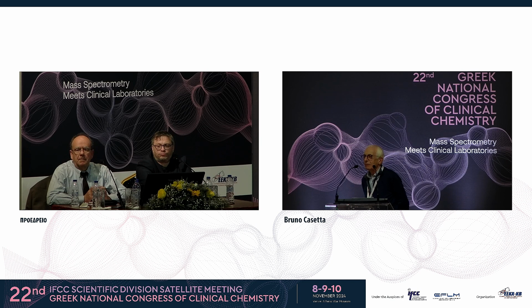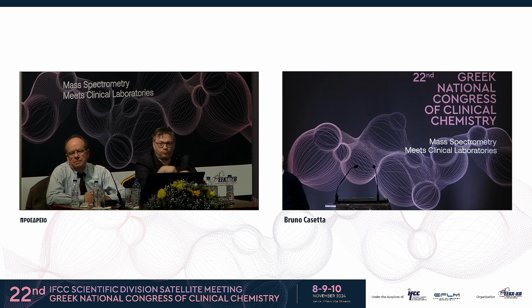Fully appreciate it. We did control those experiments as best we could, but I still have questions around the stoichiometric relationship between the number of derivatization reagents versus, say, a normal plasma profile for amino acids, and that same relationship for a pathological plasma amino acid profile. Because if you get metabolic crisis, you tend to increase the number of amines across the board. I mean, just ammonia itself will go well up. Have you increased the number of molecules or the concentration of your reagents in this instance to account for the differences between a normal plasma profile and a pathological one?